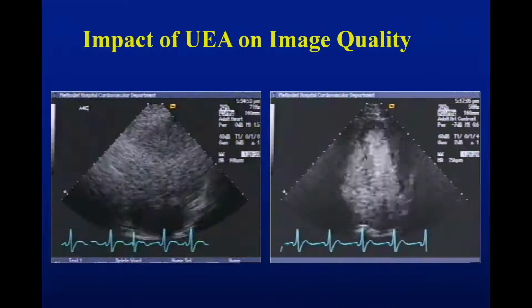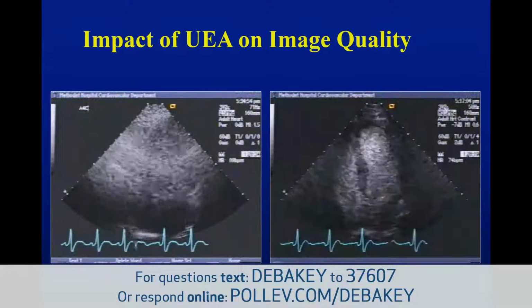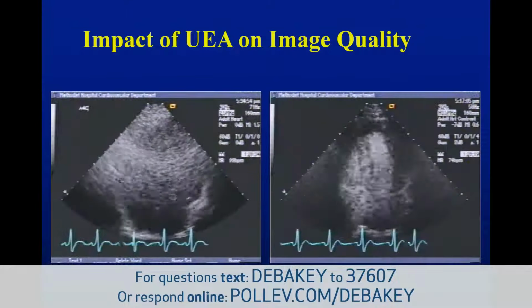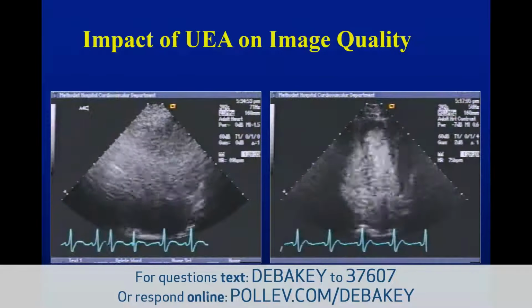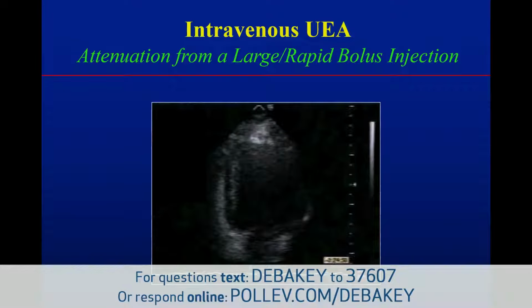So the power of such is amazing, and I think the push for utilization, appropriate utilization of contrast, is really to enhance the quality of the images that you're seeing in an echocardiography laboratory, and to change an uninterpretable study into something that is interpretable.